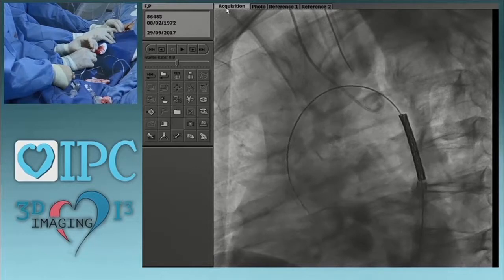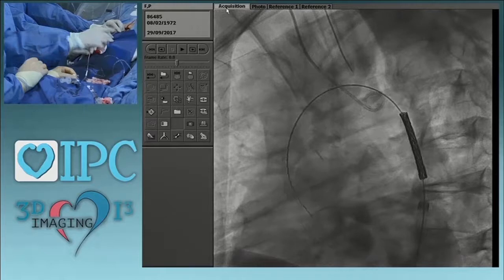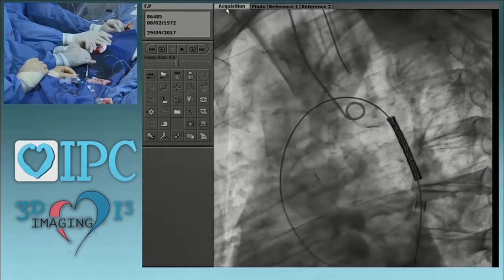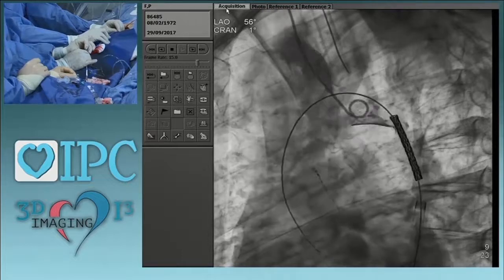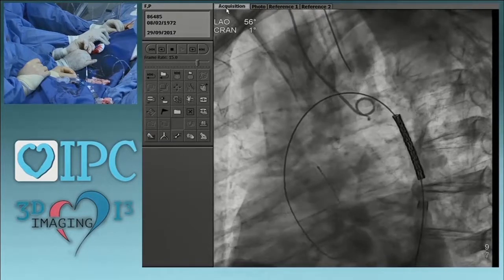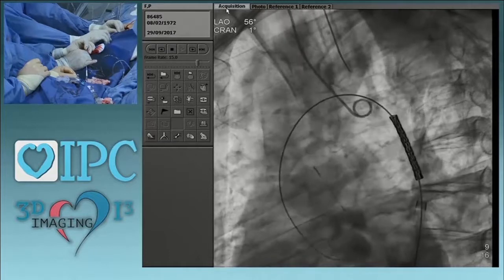And so are you going to use your overlay? Let's do an angio here. For instance, when we've gone through these tight coarctations, and I know you've got a radial and the other catheter, which is nice, but we've also deployed just under direct overlay without doing lots of other angiograms. If you trust your overlay and you've documented that the wire and everything is in position, we've done it just with overlay without a lot of extra injections.